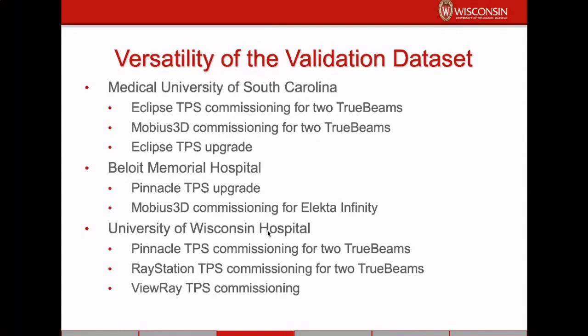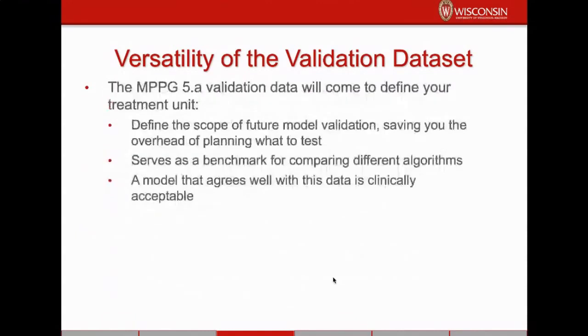In addition, we have a ViewRay, and we've done MPPG 5A for ViewRay. And ViewRay is a fairly new device, and so the treatment planning system gets upgraded quite a bit. The whole delivery system gets upgraded fairly often, and so there's lots of opportunities to reuse data there as well.